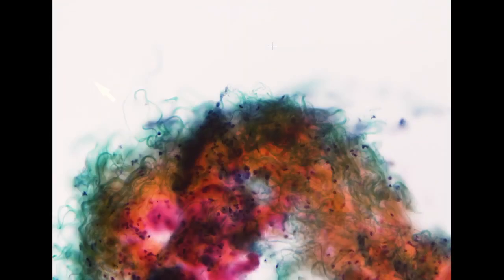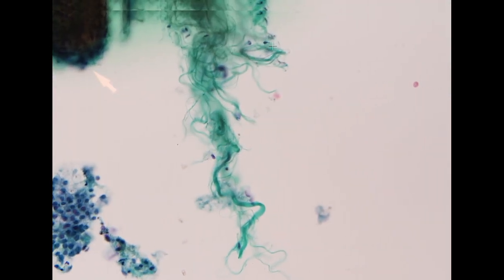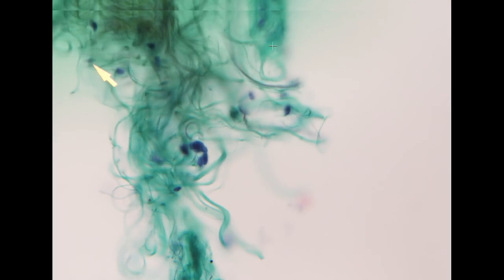This is relatively uncommon because usually the stromal component is not easy for us to aspirate. But this specimen shows very beautiful collagen along with some atypical cells.